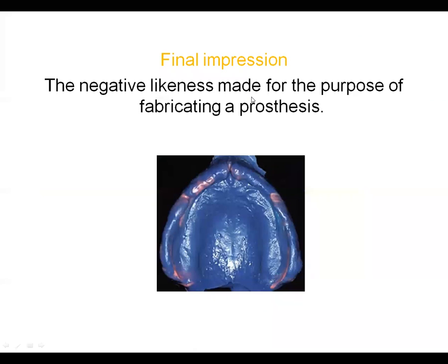As far as this picture is concerned, in this picture they have recorded the final impression in light body. We record the final impression in zinc oxide eugenol paste.